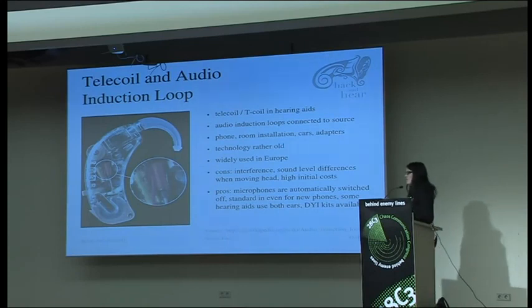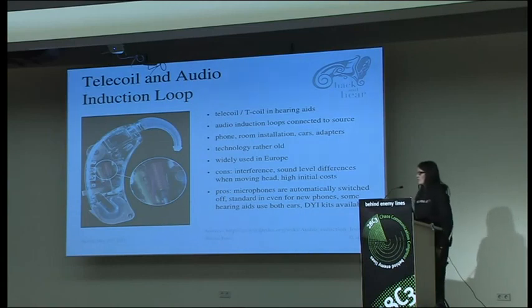And telephones also have an induction loop, even very new ones. All telephones which are called hearing aid compatible have an induction loop that can be used with a telecoil, even the new iPhone, for example.